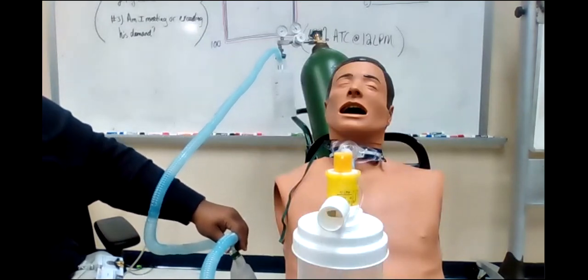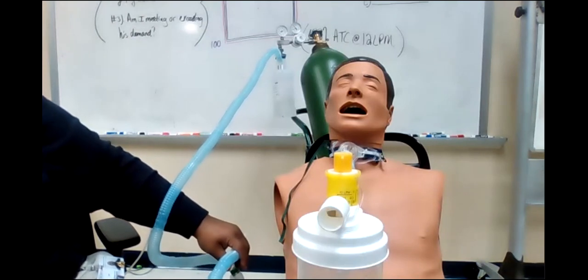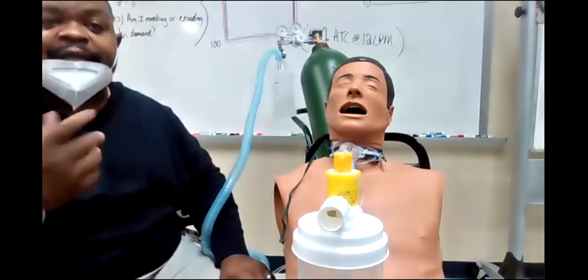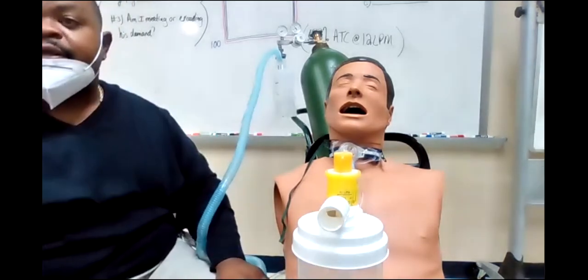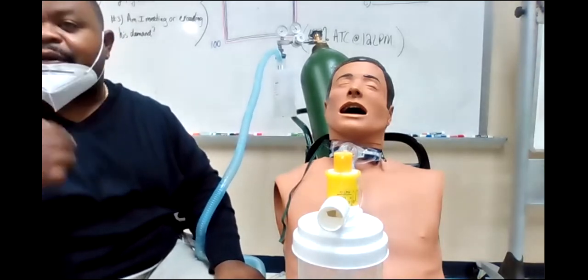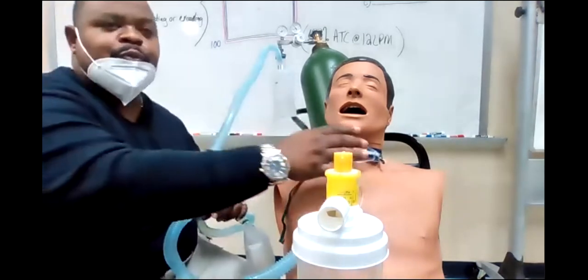I might have to do it tomorrow. I don't have my face tent. I'll show you the face tent and all that tomorrow. So it's either aerosol face tent, aerosol T-piece, aerosol trach collar, aerosol face mask, right? It depends on whatever you put on there.